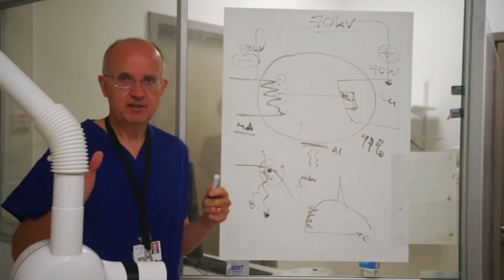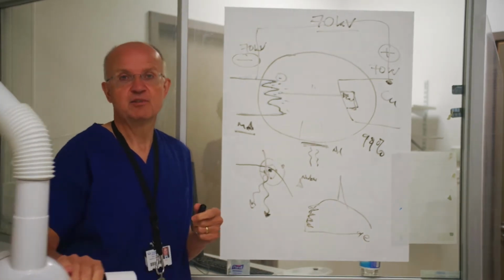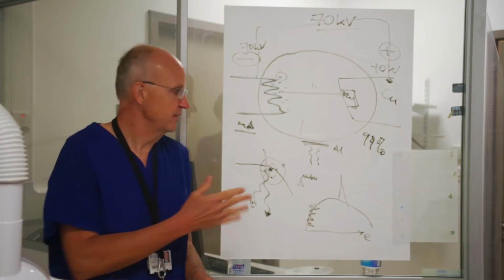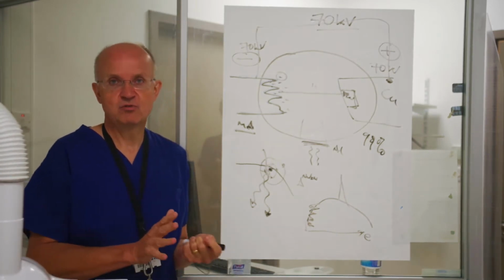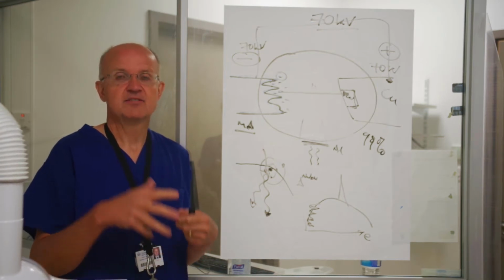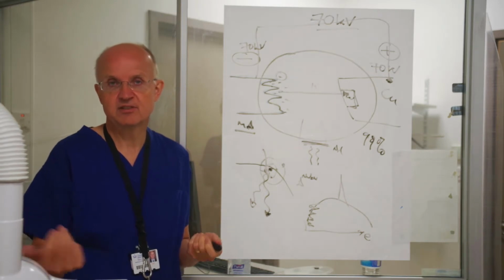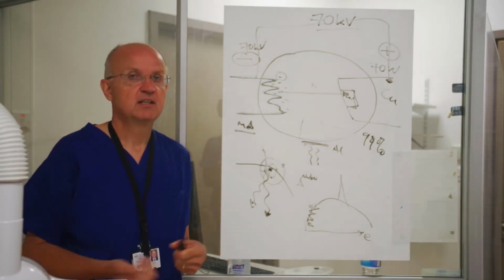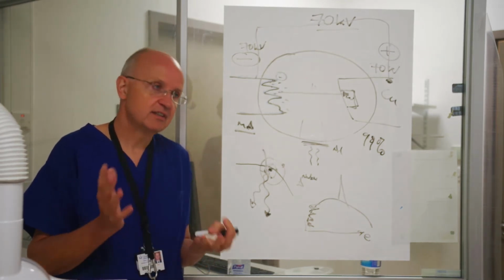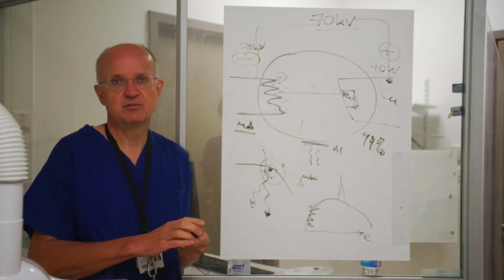Okay, so in a moment, Carlene is going to show us the X-ray tube, but the main thing that you're going to be changing, because you're going to stick with 70 kV, you've got a fixed mA tube, so for intraoral radiography, the main thing you're going to be adjusting is the time. And so Carlene is going to take us through how we change those factors on the modern X-ray tube. You will be using tubes like this, but you'll also be using older ones, which have got slightly different ways of setting them up, and we'll be talking through those with you as you come across them.